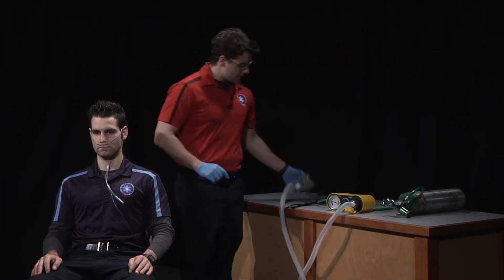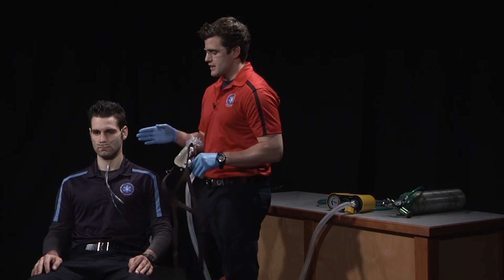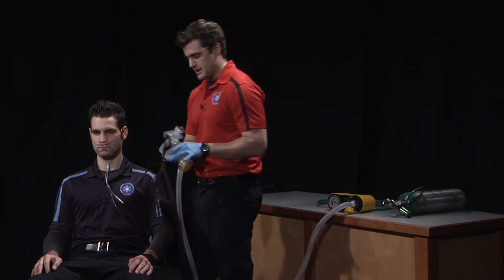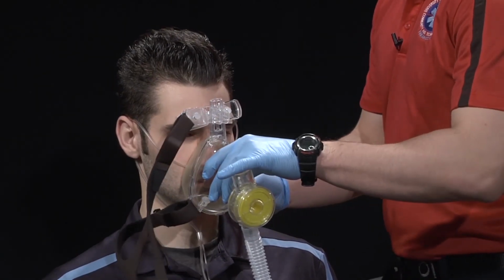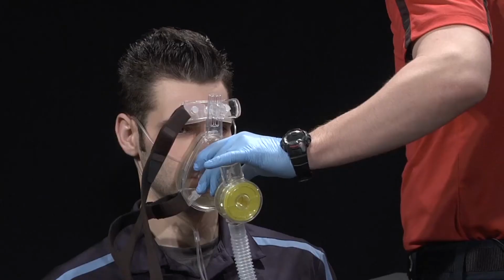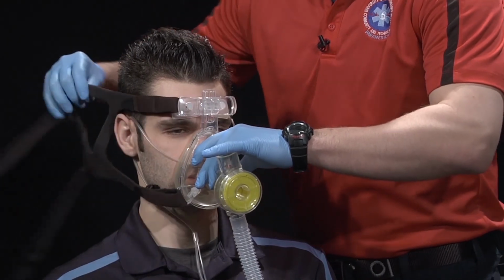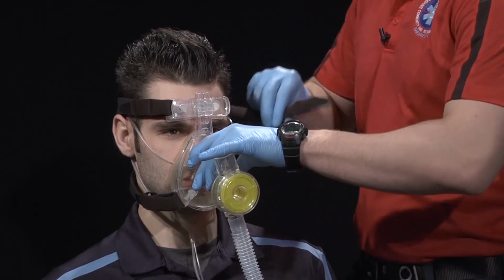From there, we're going to take our CPAP mask and we're going to place it over the nose and mouth of the patient while making sure the end-tidal CO2 nasal cannula stays in place. We're then going to titrate our machine to the desired setting and then coach the patient to breathe normally and to adjust to the air pressure while securing the mask.